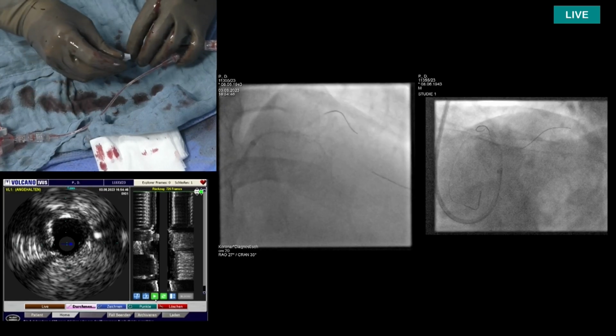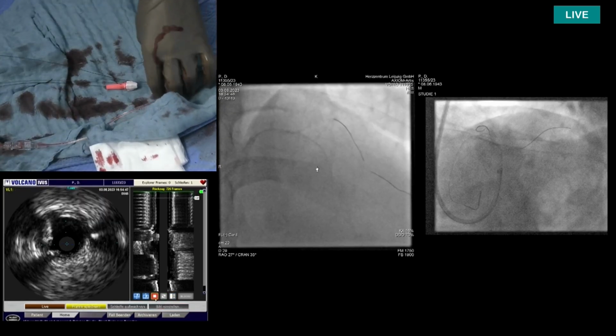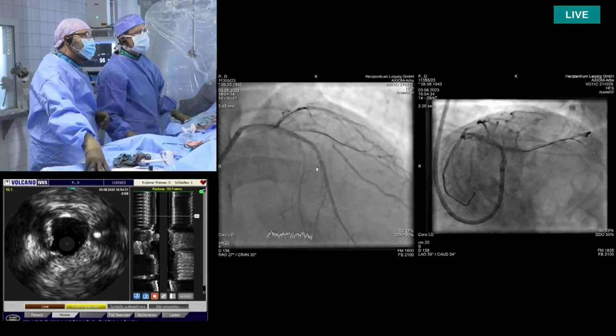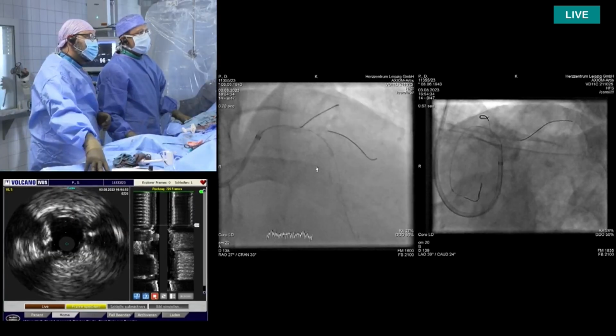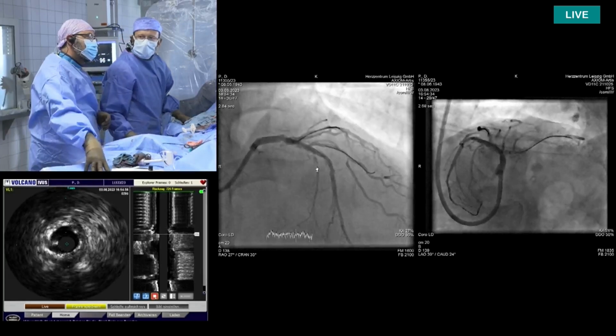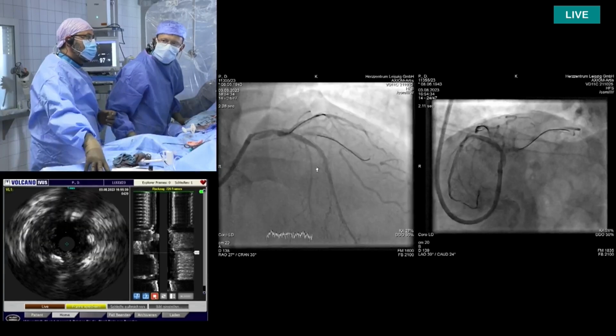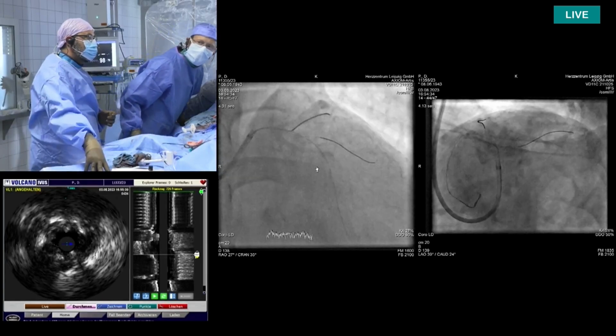Okay. So Mohamed, I agree with the stent strategy. I think 2.5, you see few cracks. 2.5 stent and POT it with a 3.0 balloon. I think we need quite a long stent. This is the angiogram now. It also looks actually well prepared now, the lesion, more or less. Can I have a look?